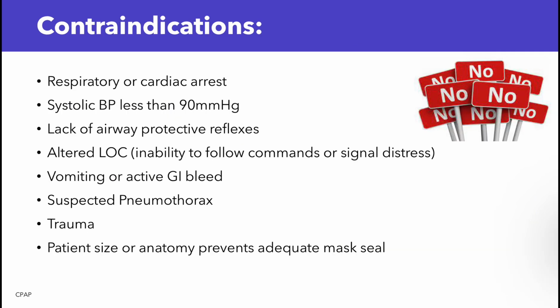Contraindications of CPAP are respiratory or cardiac arrest, systolic BP of less than 90, lack of airway protective reflexes, altered level of consciousness, inability to follow commands or signal distress, vomiting or active GI bleed, suspected pneumo, trauma, and patient size or anatomy that prevents adequate mask seal.